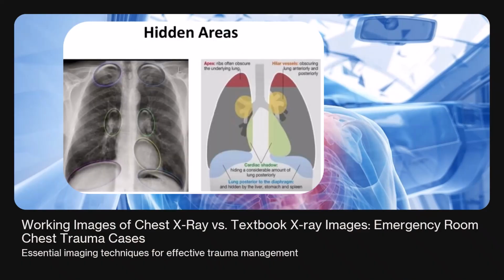After looking at the lethal injuries, we spot hidden 6 injuries, which are pulmonary contusion, an aortic injury, tracheobronchial tear, esophageal rupture, diaphragmatic rupture, and myocardial contusion. The radiographer must support clinical decisions and rapidly help flag abnormalities for the trauma team in action.